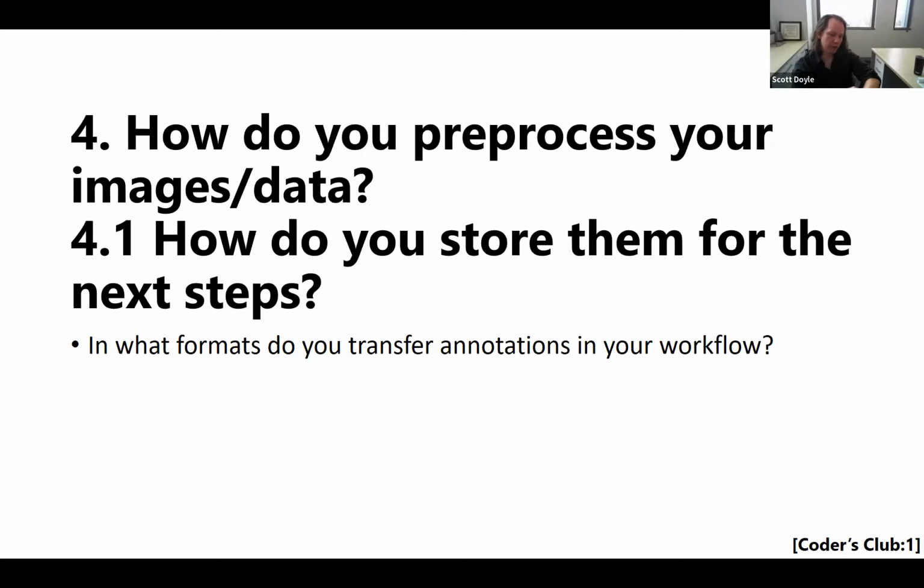We try to minimize the number of steps of storage between the raw data and what we're using for analysis, except where it's going to make it much more efficient. We try to have it where you have code that will generate your patches, or pull the annotations from whatever your platform is, and that code is fixed. And then if we need to regenerate stuff, we'll regenerate it, apply the transforms or apply the normalization steps to the data computationally. And then if we need to, you can delete those intermediate steps and keep the code.